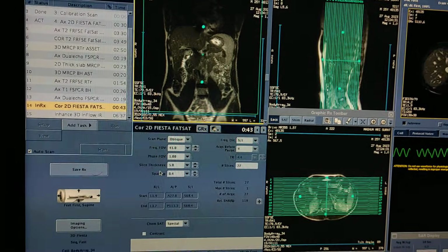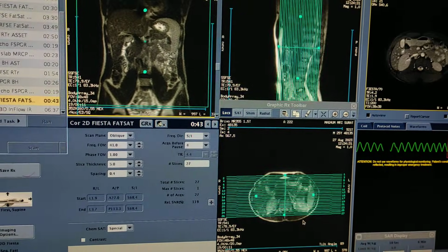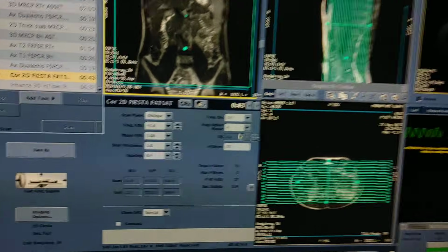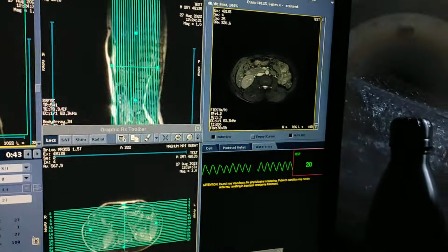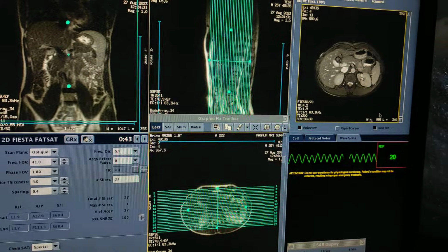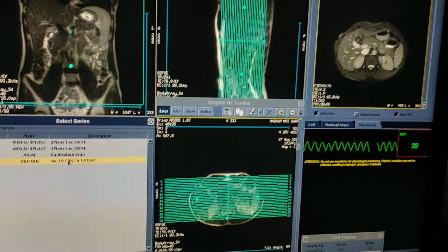So again, 5 mm thickness, 0.4 spacing. You have to cover anterior to posterior the whole of the liver. This is also breath hold, but I am removing the intervals and doing 0. It will take continuously without a holding breath. So this is axial. I will click on the axial box and enter an axial 2D Fiesta.